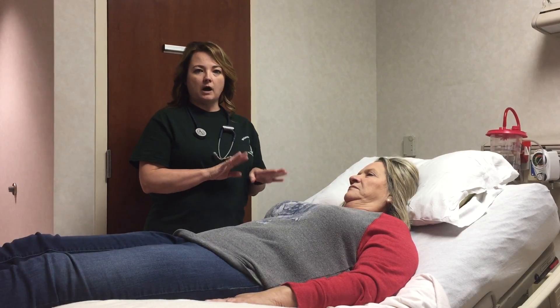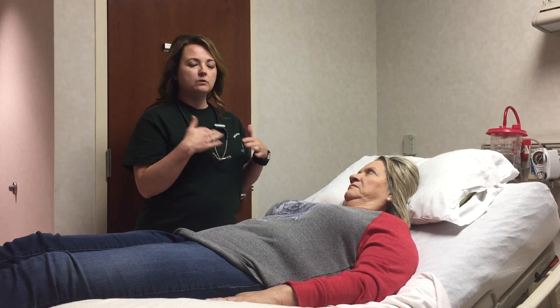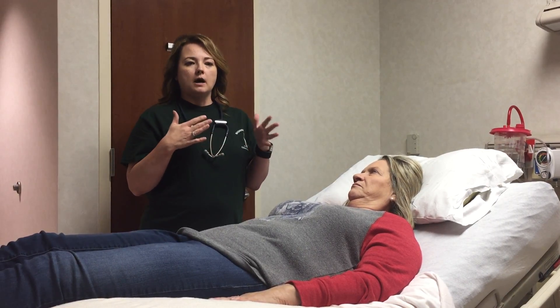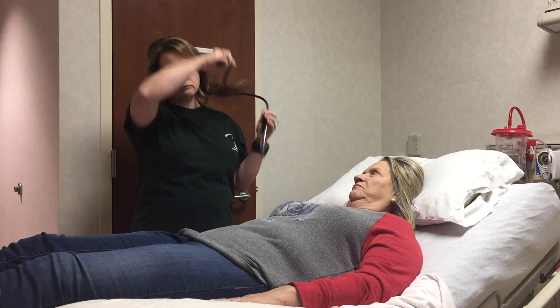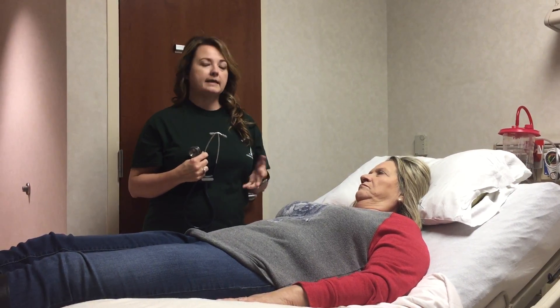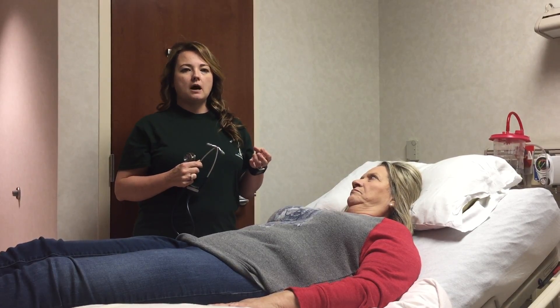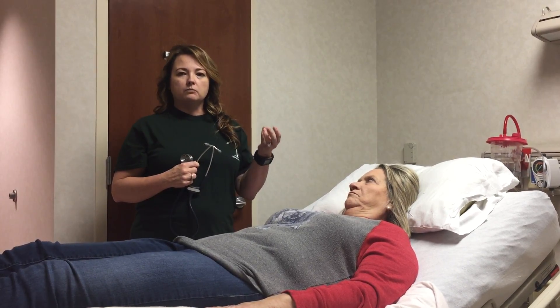After palpation, we'll move on to auscultation. For this demonstration, I will be auscultating with the diaphragm, but in a clinical setting I would auscultate all areas with both the diaphragm and the bell, because there are different pitches that you will pick up with each. When I am listening, I'll be listening for the presence of normal heart sounds, which are S1 and S2, and also abnormals, which are S3, S4, gallops, friction rubs, and clicks. I will also be assessing for rate and rhythm, looking for bradycardia — less than 60 beats a minute — or tachycardia, which is greater than 100 beats a minute.